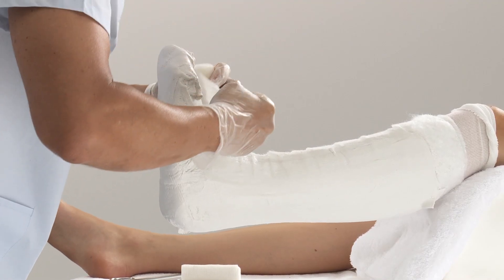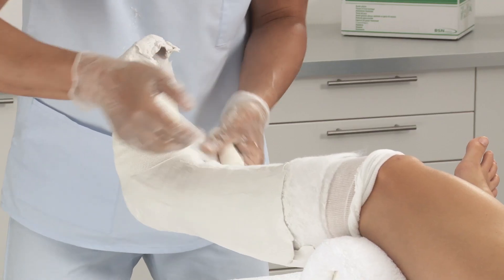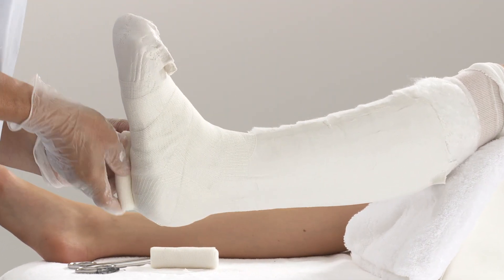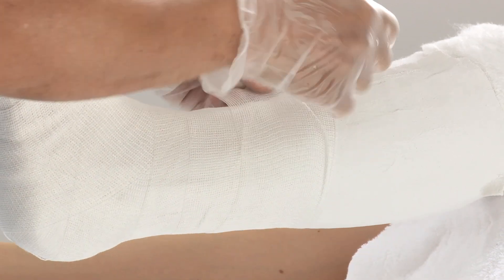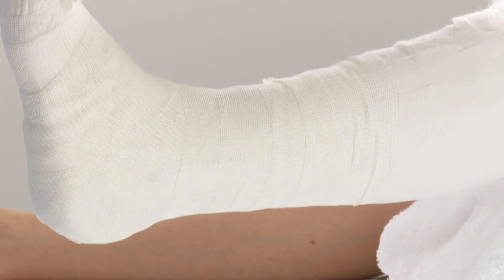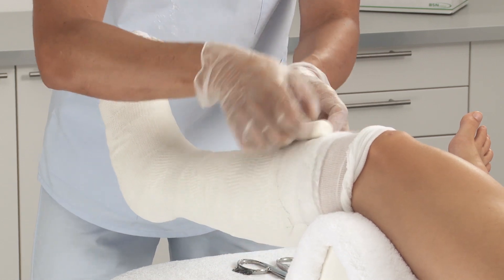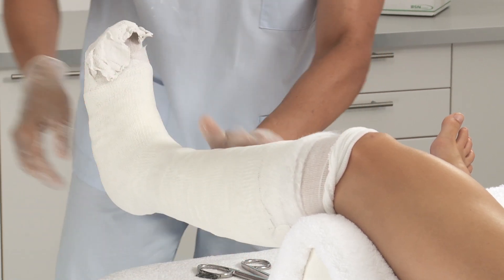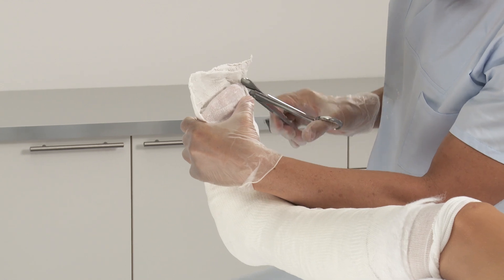Secure the splint into place with bandages, leaving the toe area free. Hold the splint in place for a while, then cut away the surplus splint from around the toes.